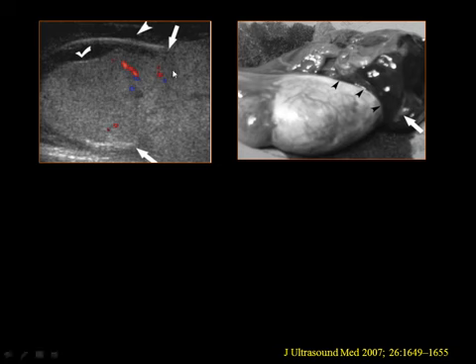This is an example of testicular rupture. Here we can see interruption of the tunica albuginea and extrusion of an isoechoic lesion representing the testicular contents. The surrounding hypoechoic lesion is suggestive of hematocele. The subcapsular hypoechoic lesion is a subcapsular hematoma. No flow signal is seen in the extruding isoechoic lesion, and here surgery confirms testicular rupture with extruded testicular contents covered by hematoma.